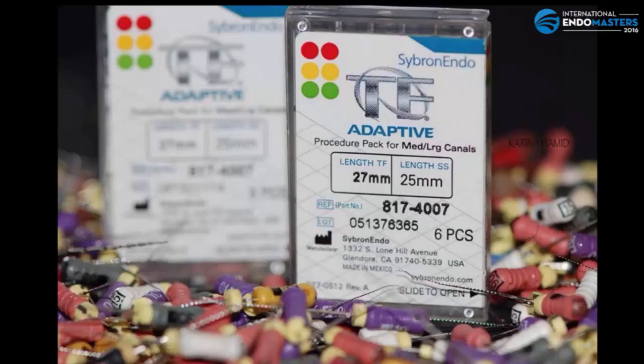The TF Adaptive files come in a kit that includes 3 manual files, number 8, number 10, and number 15, and 3 rotary files, the green, the yellow, and the red. The rotary files come in 2 lengths, 27 and 23 millimeters, and all the manual files are 25 millimeters.